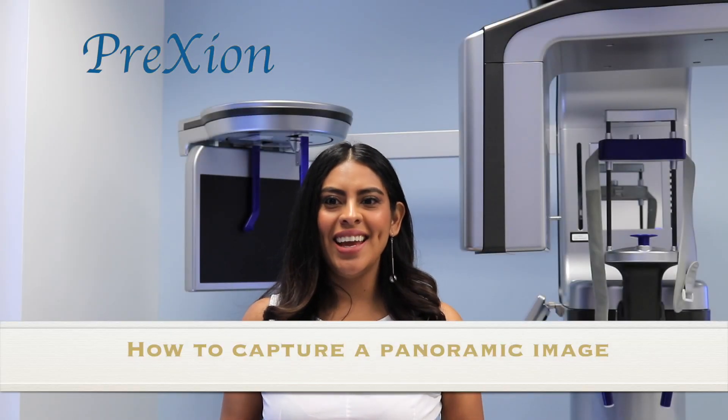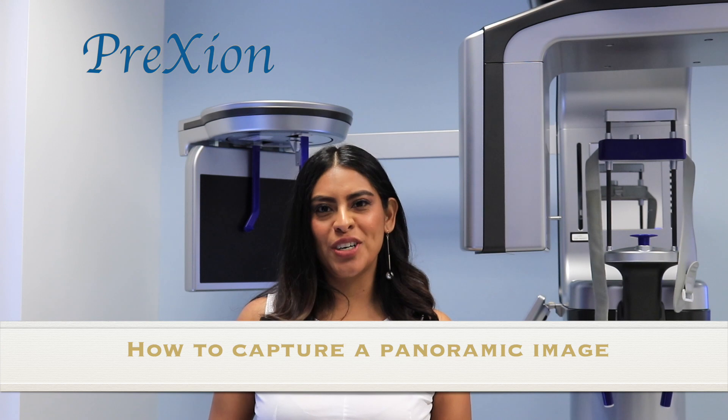Hi, I'm Jennifer with Prexion. In this video I will show you how to capture a panoramic image.